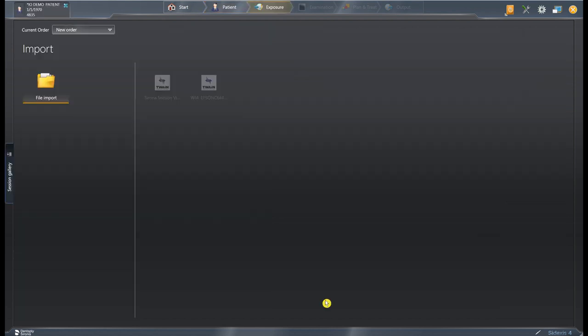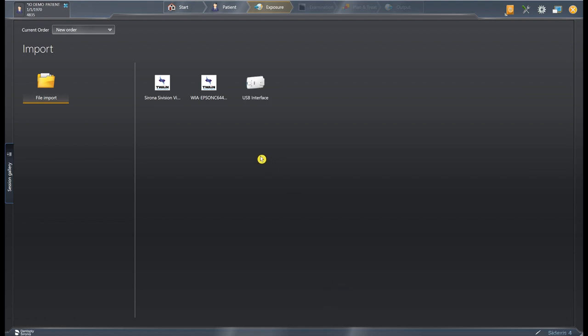So as you can see on our exposure screen right now it doesn't really have anything for us to select, so I'm actually going to plug a Schick sensor into my computer. That gives us not only the option to select the USB interface but now it gives us the option to select our Schick 33 sensor.